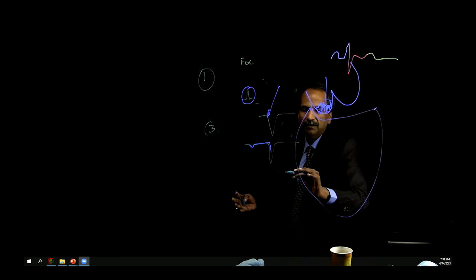So our catheter here is overwhelmed by this large signal with the big antenna of the unipolar, that is what's producing the QS. Now, if there is enough muscle there, we may see this so-called W pattern, where we have a small unipolar that tells you you're at the focus in the little part of myocardium prior to getting to the big part of the myocardium.